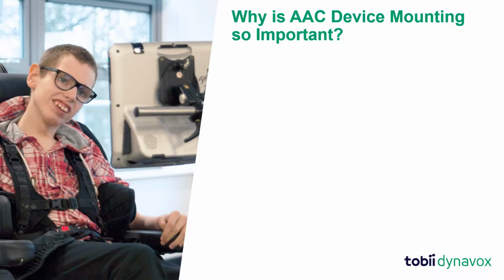But first, why is AAC device mounting so important? There are 3 major reasons why AAC device mounting is such an important topic. First, let's talk about safety. When we talk about safety, we want to consider the device user, the communication partners, and even the device. A mount can help ensure safety.